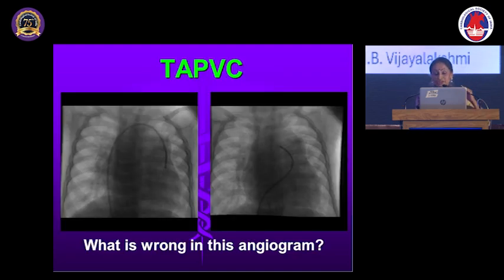So what are the conditions where the left heart catheter goes into the RV? DORV. So whenever there is a DORV, instead of entering the LV, the catheter will enter the RV. Give her a big hand. That's how you have to identify, that is the trabeculated one.